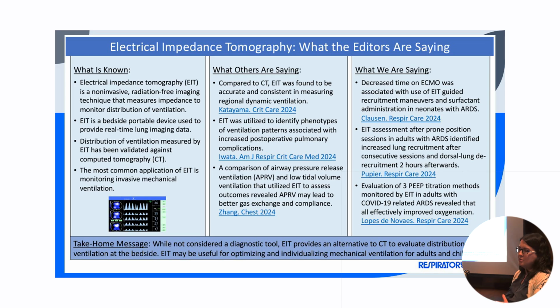Again, I don't do ECMO with neonates at our facility, but glad to see that EIT and ECMO is being paired in that population. And these last two studies, again, have more to do with lung recruitment, PEEP titration, utilizing EIT.